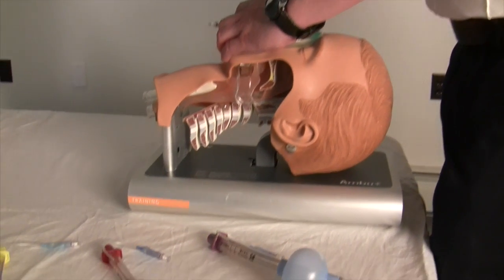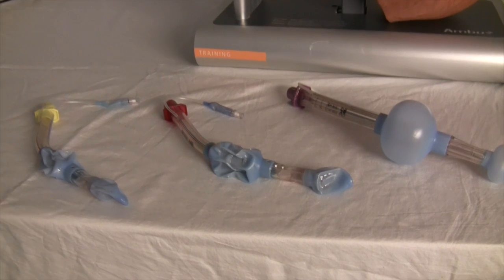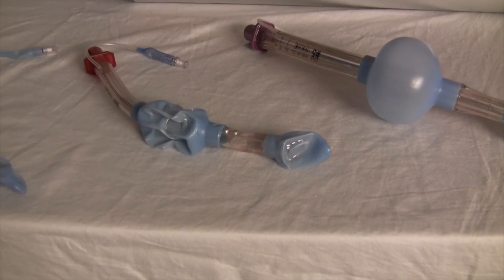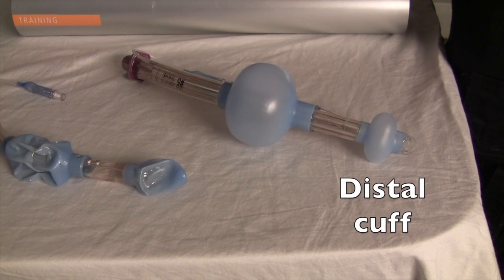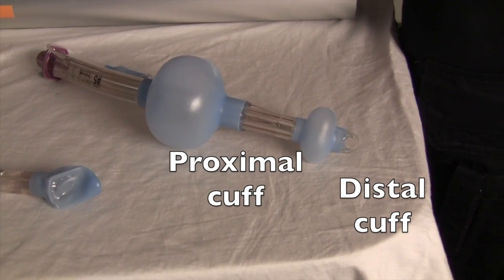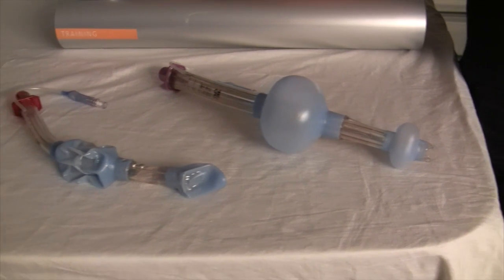The King Airway consists of a curved tube with ventilation holes located between two inflatable balloon cuffs. Both cuffs are inflated using a single pilot balloon. The distal cuff seals the esophagus, while the proximal cuff is intended to seal the oropharynx. The connector is a standard 15mm respiratory connector.